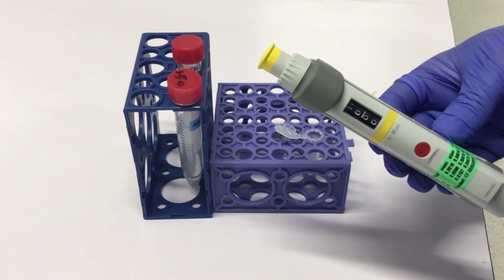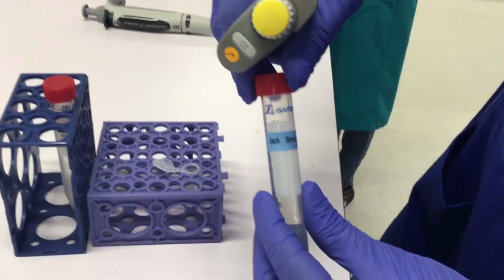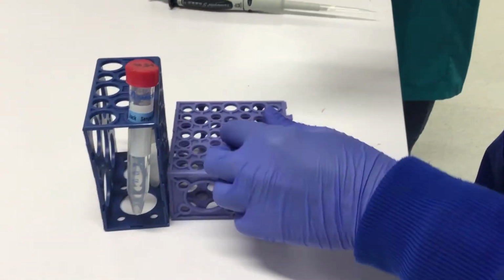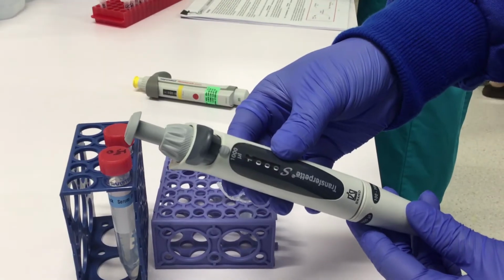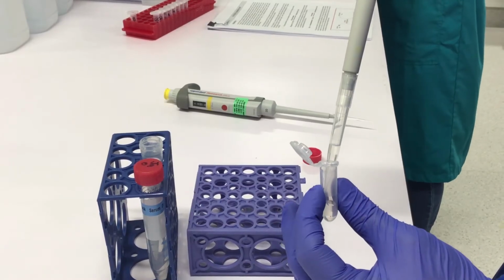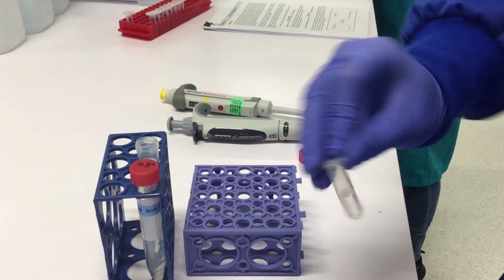Here's a little video of what to do. You take 10 microliters of the patient's serum sample, put that into your tube, followed by 1,000 microliters, or 1 milliliter, of the glucose oxidase assay reagent. Just to point out, the assay reagent contains a lot of different things. It has your 2 enzymes, phenol, and 4-aminophenazone. So that makes it a lot simpler for them.